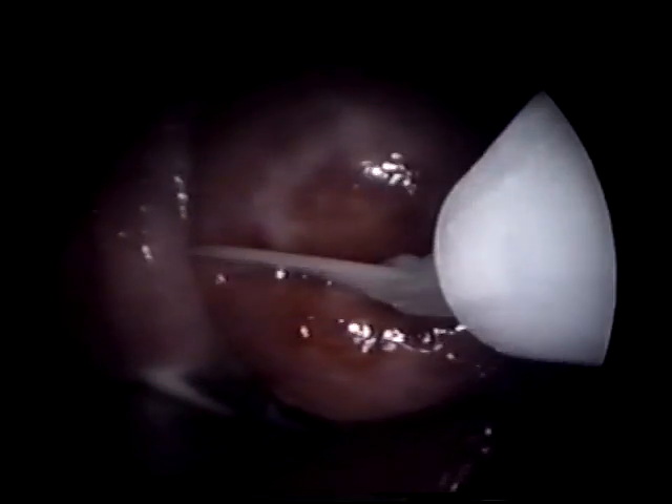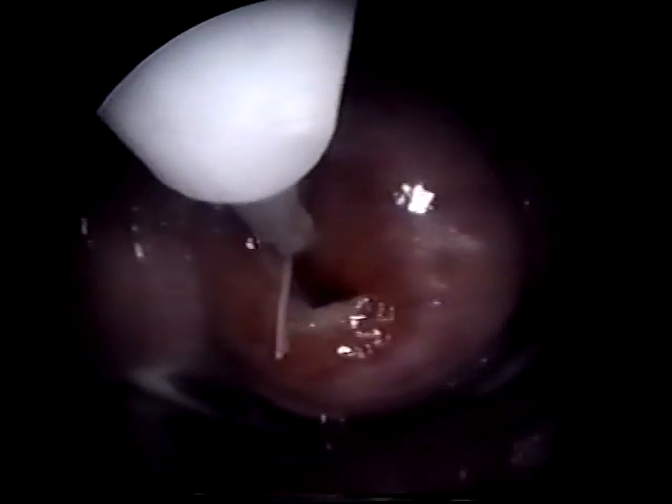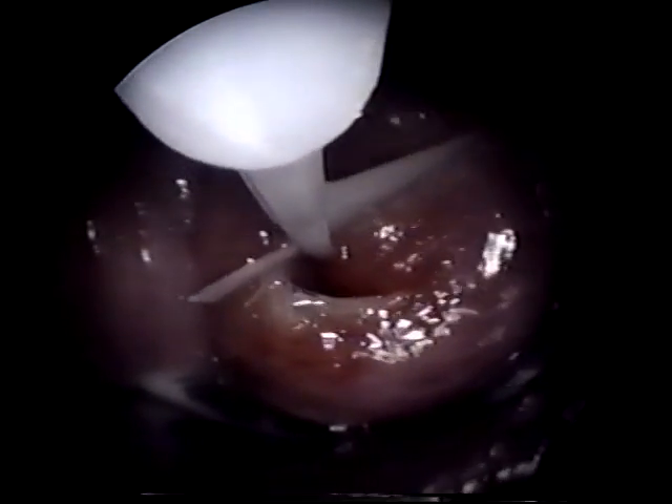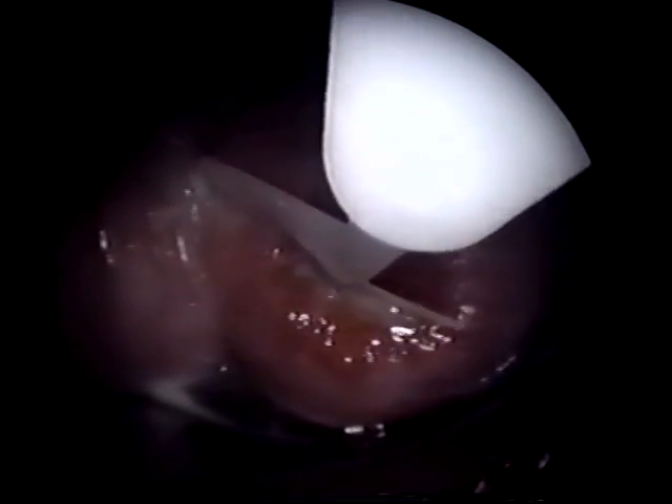To accommodate these cervical variations, CellSweep may be maneuvered for complete and proper insertion into the cervical canal. While the endocervical canal is being sampled, the ecto-cervix is simultaneously being sampled by the solid blade and the bristles that are remaining outside the cervix.